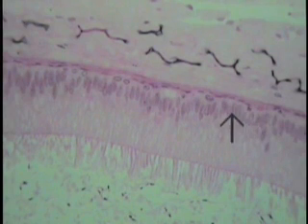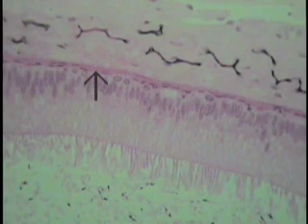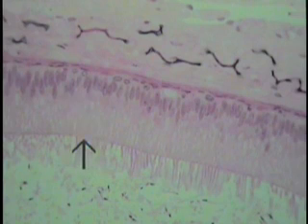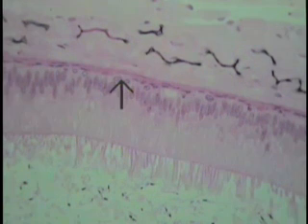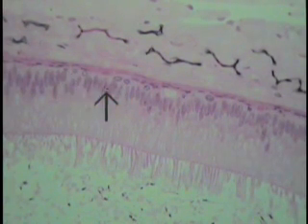It, once again, consists of two cell types. The cell type known as the principal cell, and basal cells make up the second. The nuclear profiles are here, so you can see it as a fairly tall columnar epithelium, at least that principal cell is, extending from about where the tip of the pointer indicates to approximately this location. Also located within this epithelial layer are little round cells that hug the basement membrane. These are called basal cells, little germinal type cells that are replacement cells. Nonetheless, both touch the basement membrane.